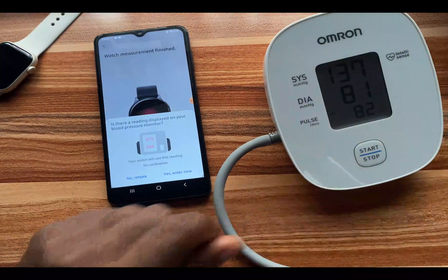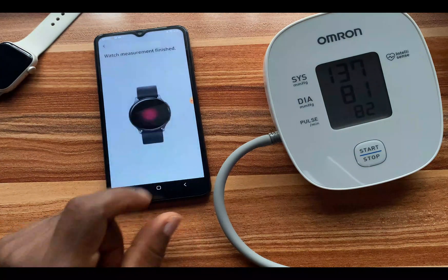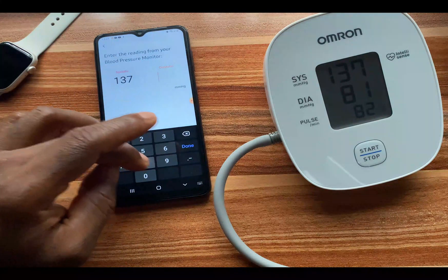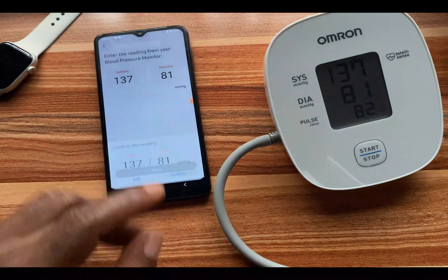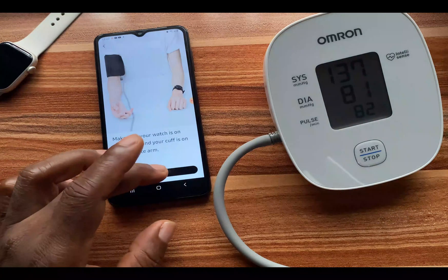The second reading is here. The systolic is 137 and the diastolic is 81. I enter 81 and tap 'Done,' then confirm. I'll tap 'Next' to proceed to the last measurement.